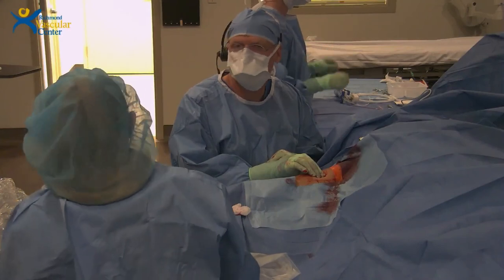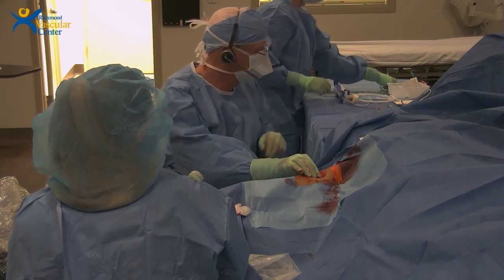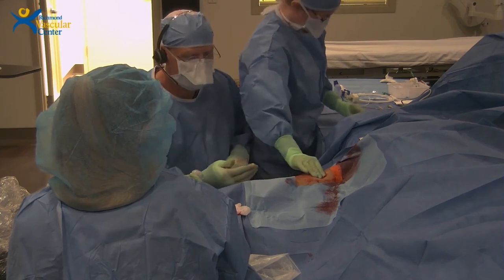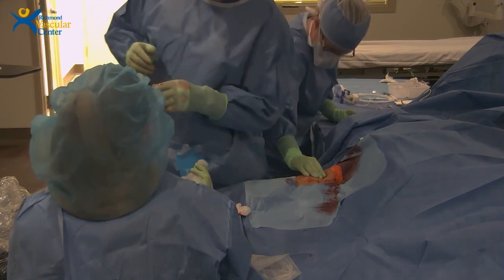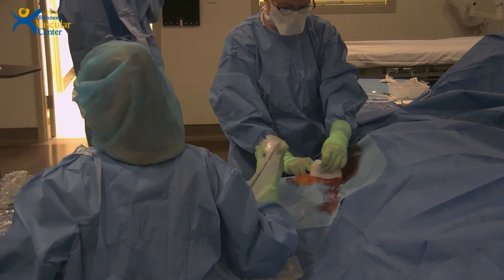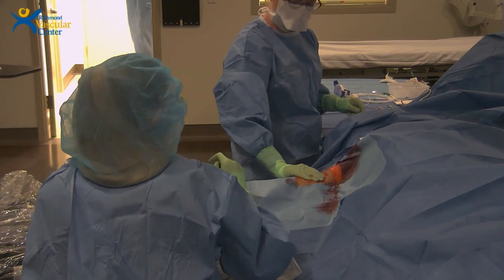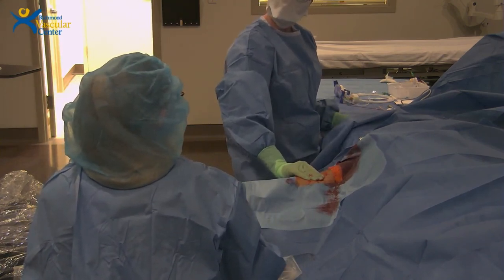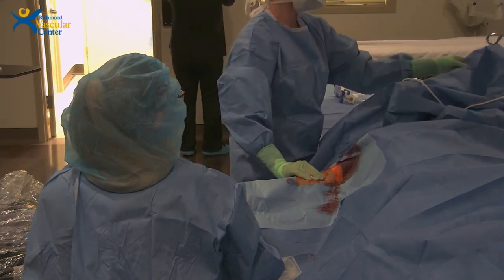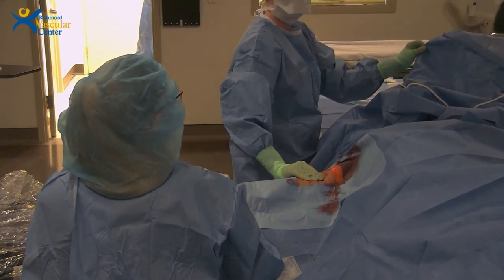The procedure itself looked really straightforward. When you bring them back for a follow-up, what do you do at that visit? Is 1 week the proper time point to bring them back? Yeah, 1 week. The 1 week visit is, number one, to make sure there are no complications. Number two, to review with them, because they often forget that at 4 weeks you're going to prepare them for dialysis. It gives you another opportunity to say, at 4 weeks we want your fistula to be used for dialysis, and it'll be the day after the next visit. It lets us be a little more precise about what we're actually going to do.